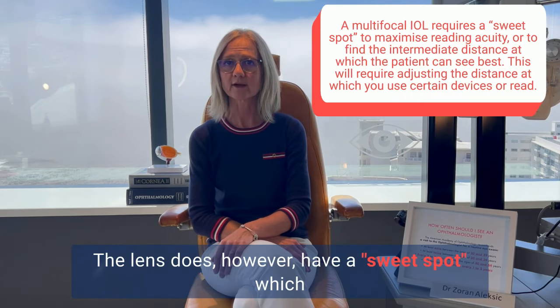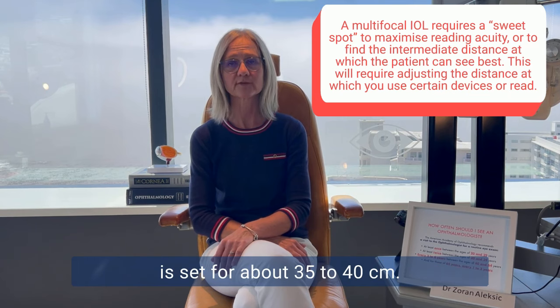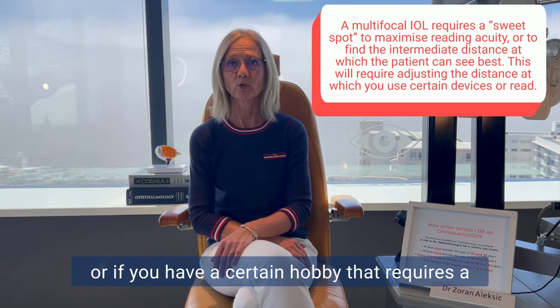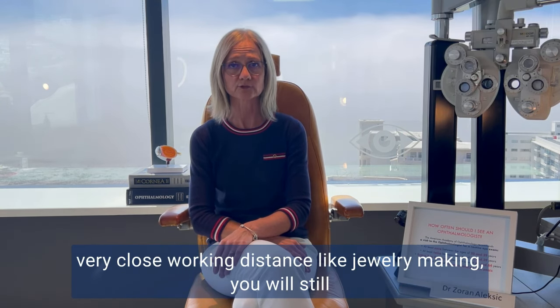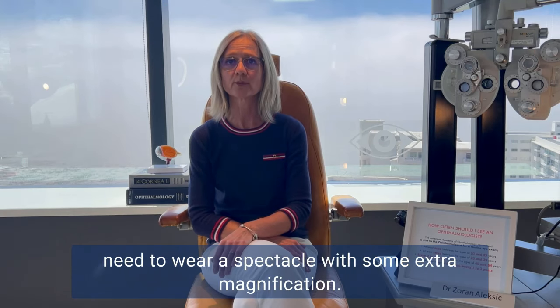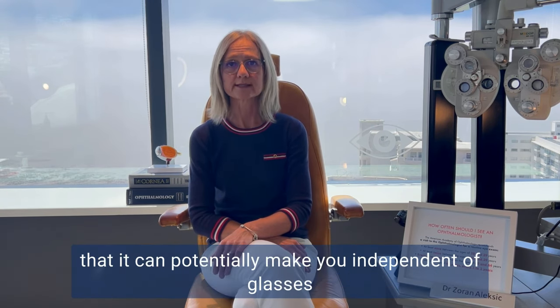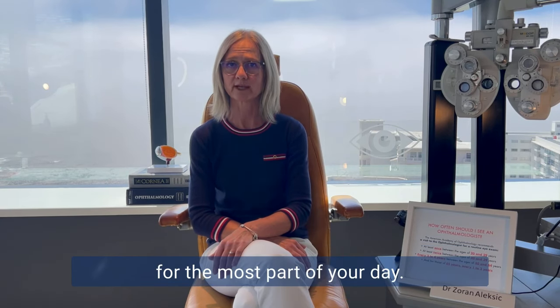The lens does, however, have a sweet spot, which is set for about 35 to 40 centimeters. If you have to do something like threading a needle, or if you have a certain hobby that requires a very close working distance, like jewelry making, you will still need to wear a spectacle with some extra magnification. So the big advantage of a multifocal lens is that it can potentially make you independent of glasses for the most part of your day.